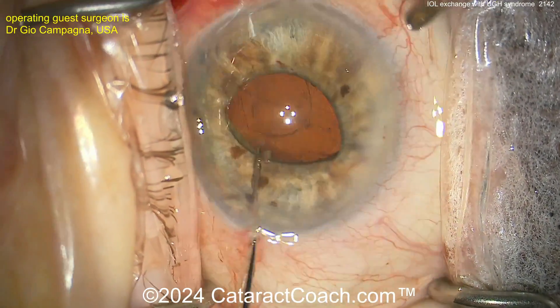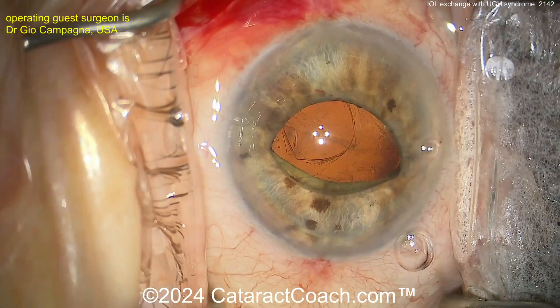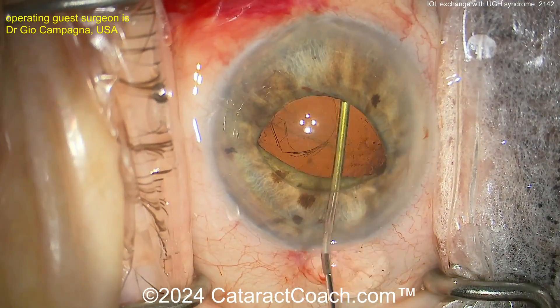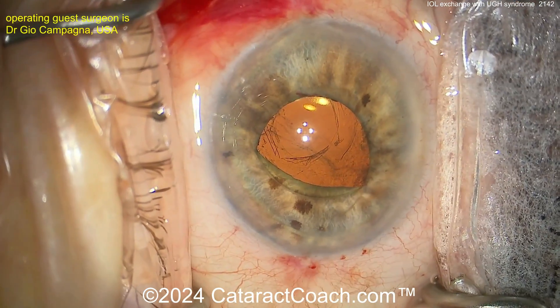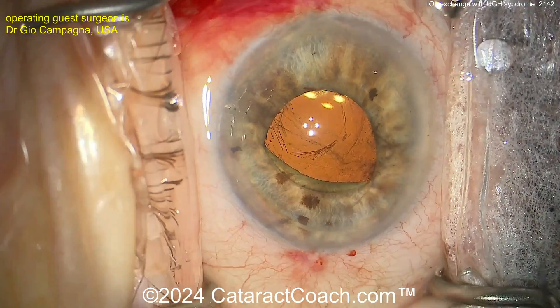It's fraught with issues and complications like this, so this IOL has to be exchanged. You want to put in a three-piece lens if you're going to place in the sulcus. Ideally, you want it with a smooth, rounded edge.